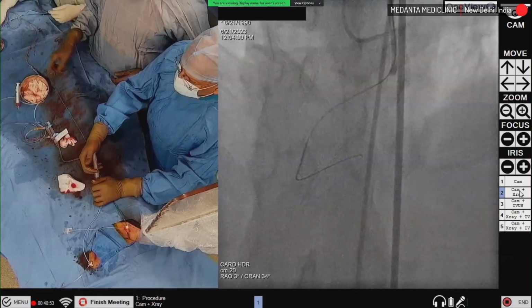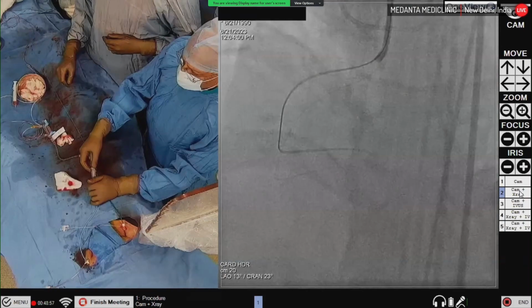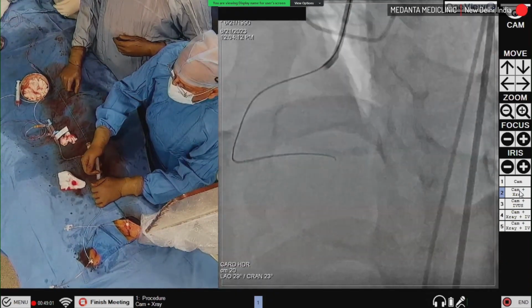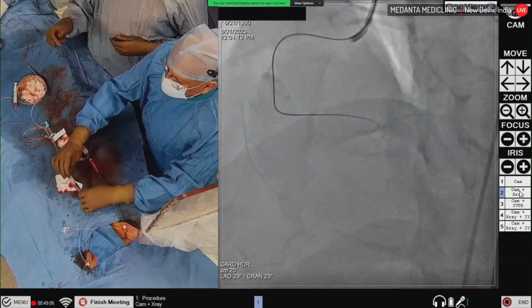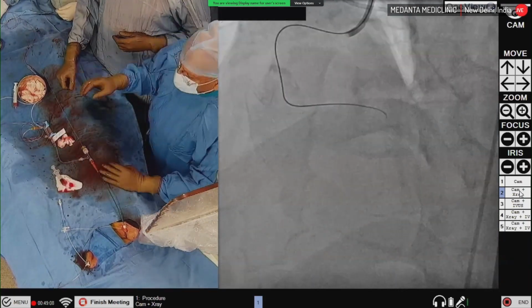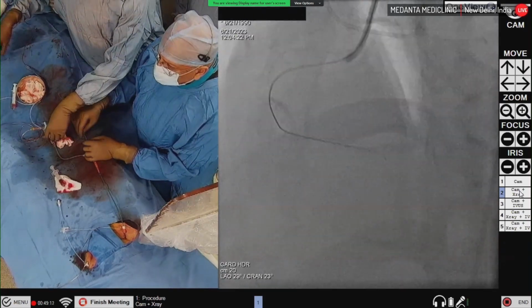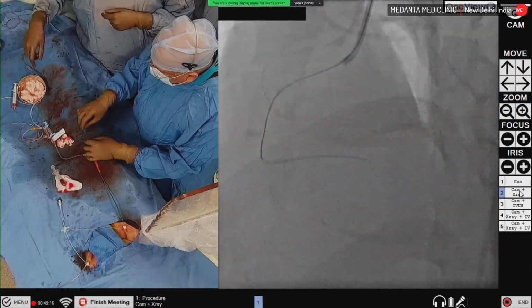Okay, go to LAO, little cranial. Okay, fine. No, I think we are not in the good branch. So we'll have to abandon it.